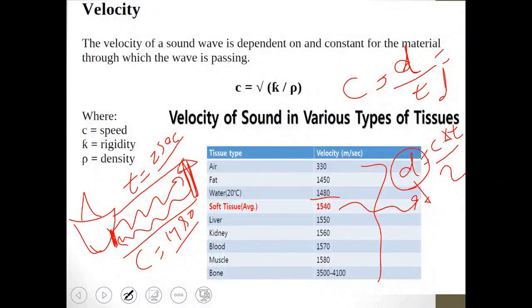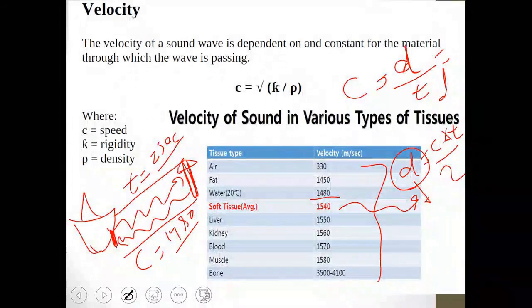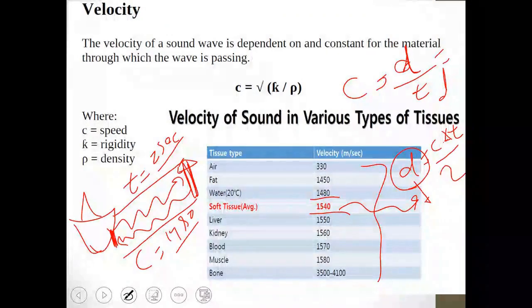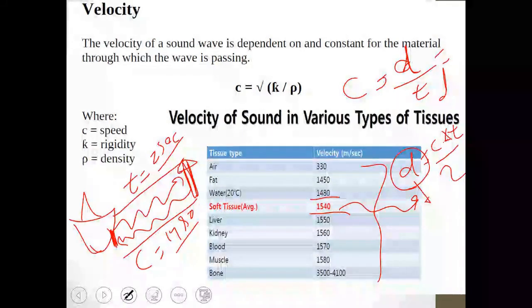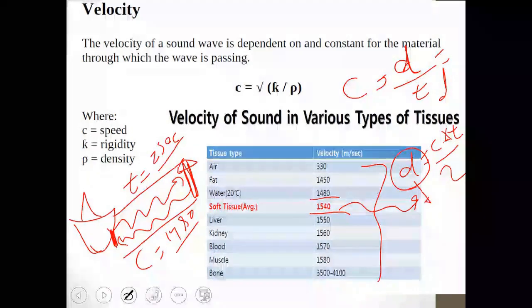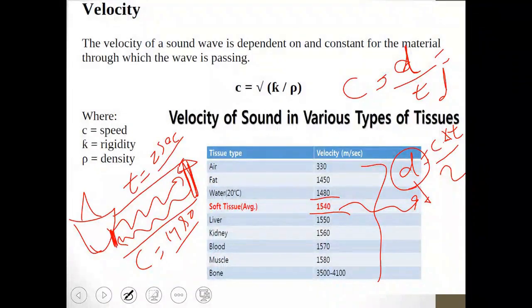So it starts telling you that this signal returned in this amount of time. Okay, since I know the speed, I will rely on it in my calculations. Then it starts to tell you that in this case, you should get what is available from my calculations, or I can get the depth that is available from our calculations.